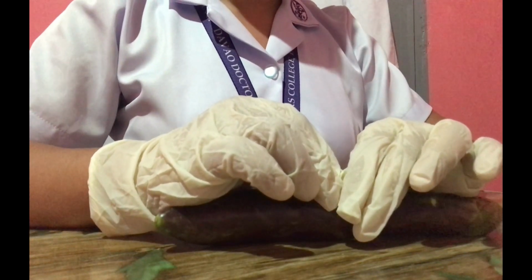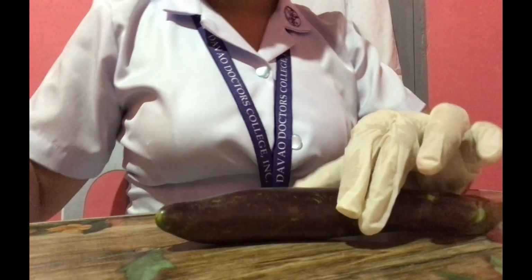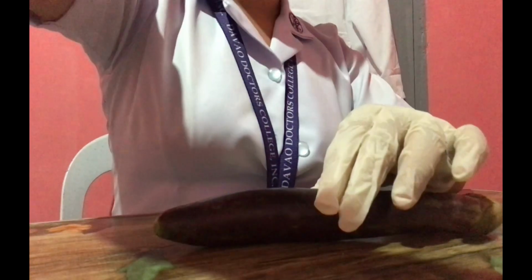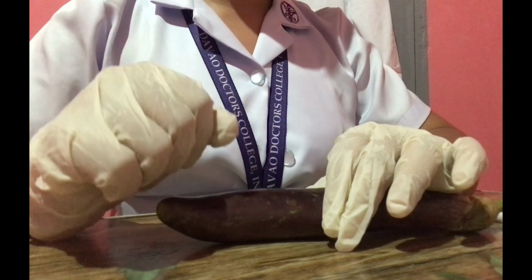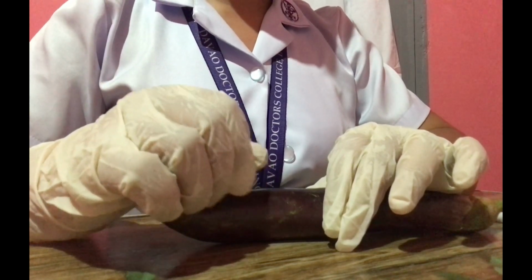Then we have to dispose of the used syringe into the waste receptacle. Assist the patient into a comfortable position. Flip down the medication ticket if not using an eMAR.